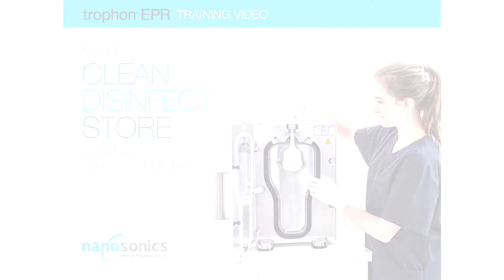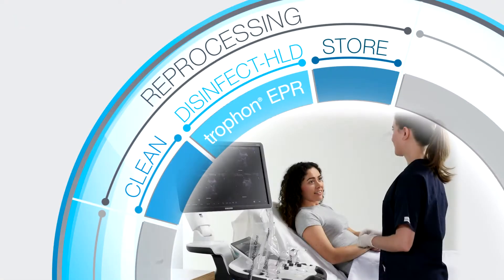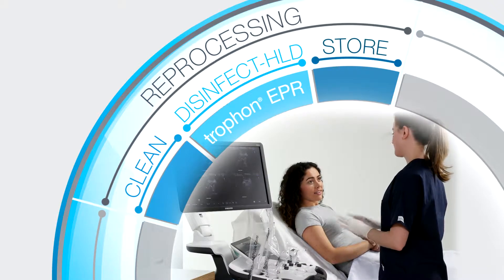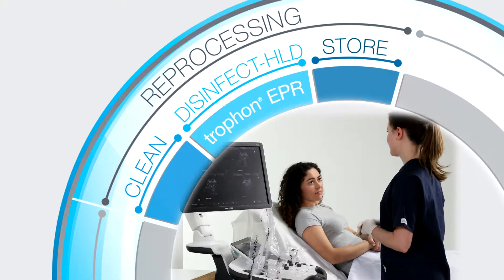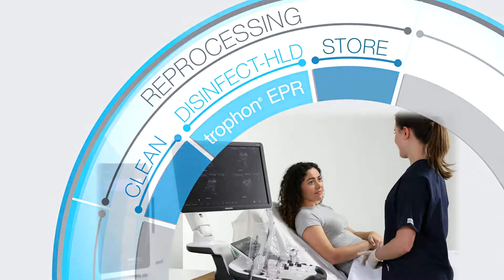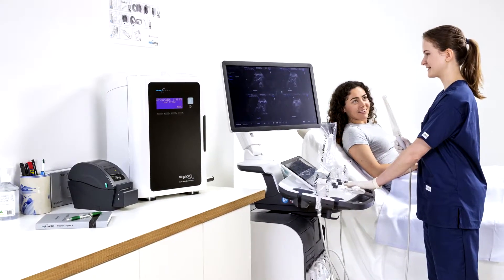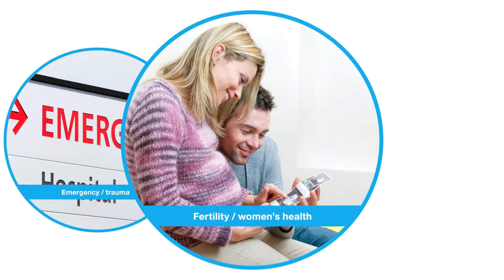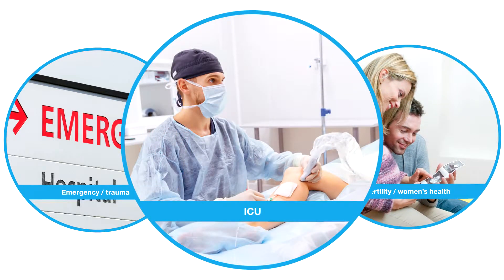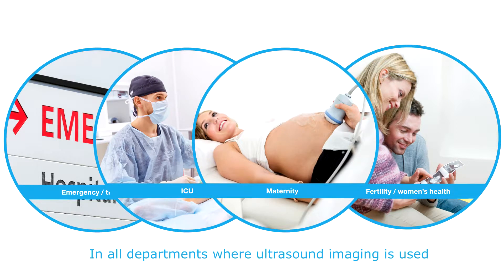TROPHON EPR Training Video – How to Clean, Disinfect, and Store an Ultrasound Probe. With the expansion of ultrasound procedures to many and varied clinical settings, especially at point-of-care, ultrasound is now becoming a cornerstone in the diagnostic and treatment of patients. New technologies such as TROPHON EPR make point-of-care disinfection possible. In order to reduce the risk of cross-contamination between patients, it is important to reprocess ultrasound probes before each patient properly so they are ready for the next semi-critical or critical procedure.